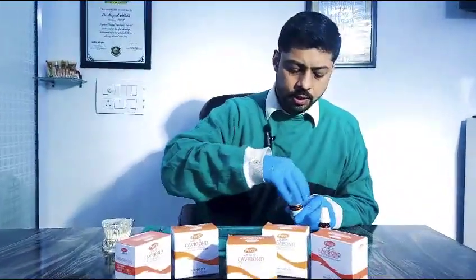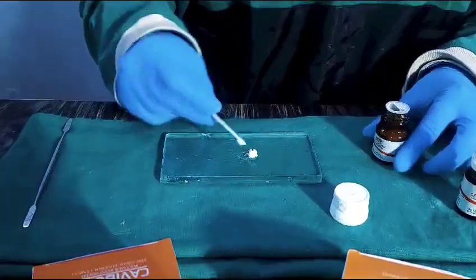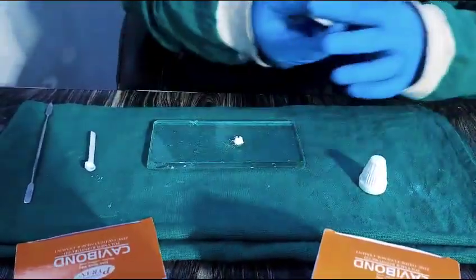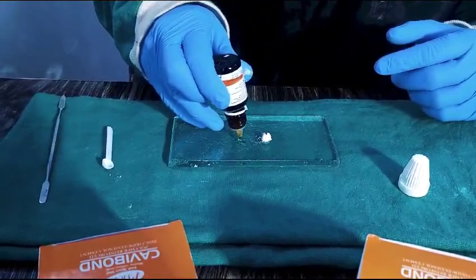Let's see how it works. Use the dispensing spoon, take the adequate quantity, and put one drop — I recommend two drops.